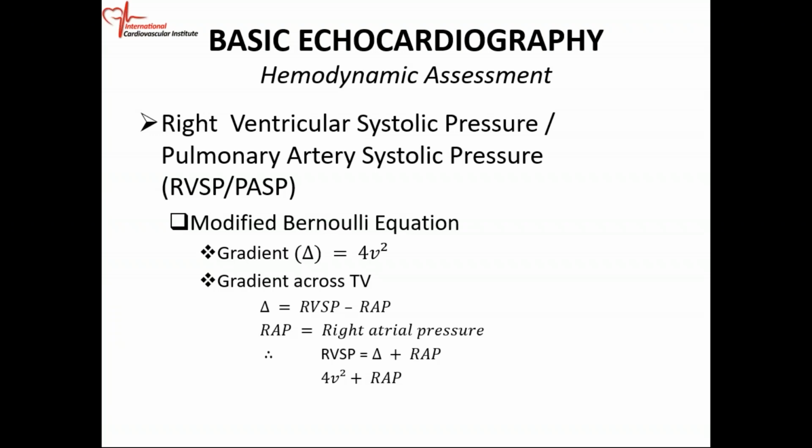And you can start diagnosing pulmonary hypertension. Just by using the modified Bernoulli equation, we can get the pulmonary artery systolic pressure.